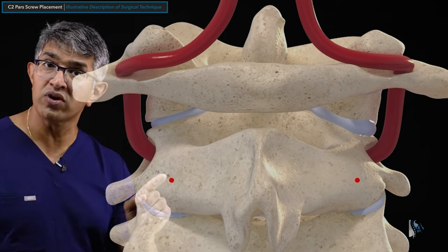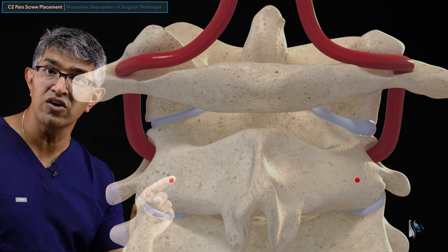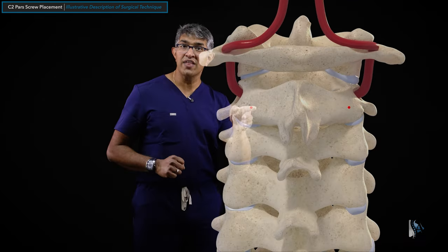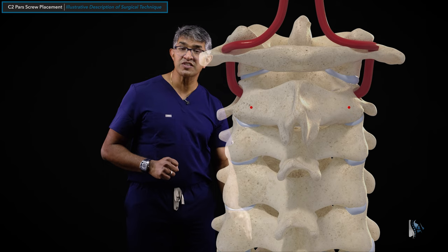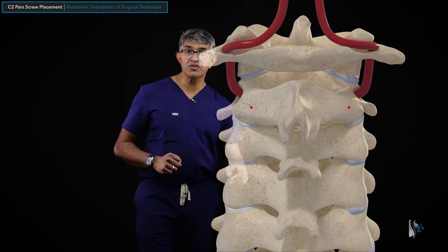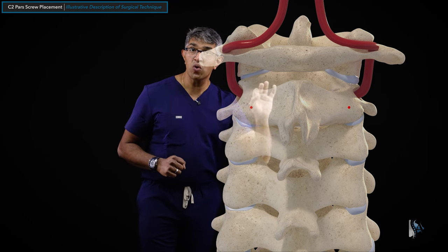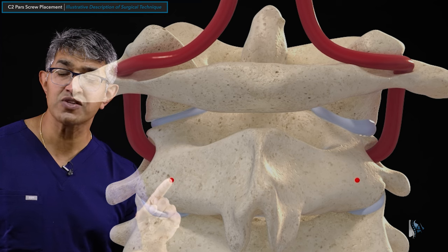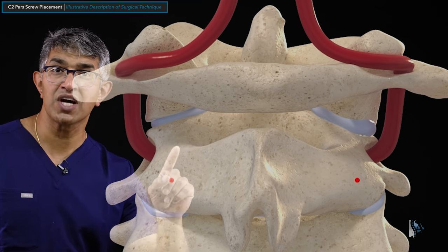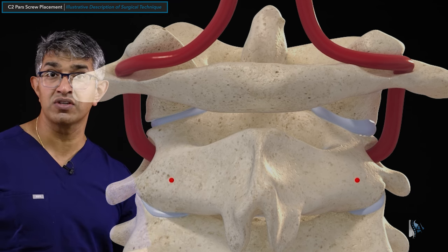A good start point is right where the red dot is shown — kind of right here, which allows you to go into the PARS. That red dot lines up nicely with the screws that go down below it at C3 and C4, and would articulate nicely with a screw going into C1. The start point is around the midpoint between the top of the PARS and the bottom of the inferior articular process — that is a good start point.